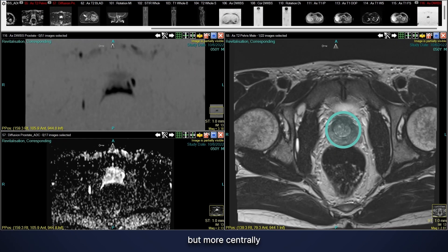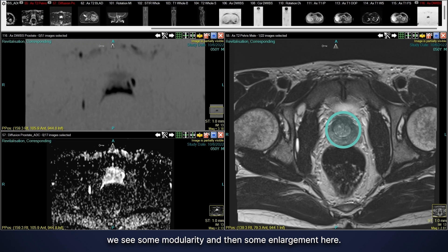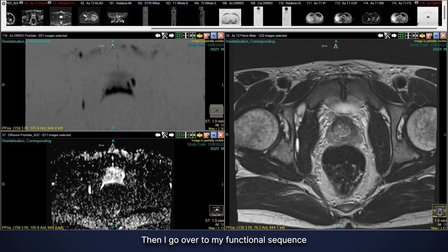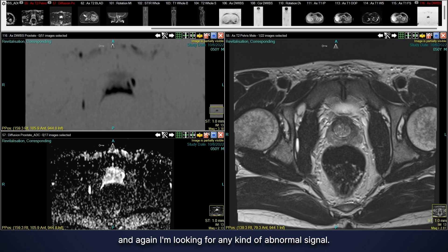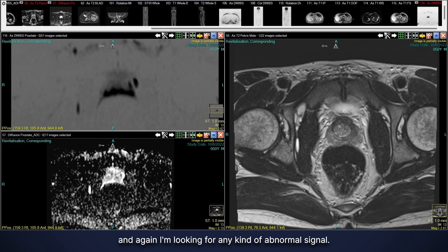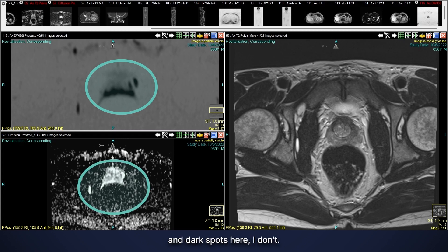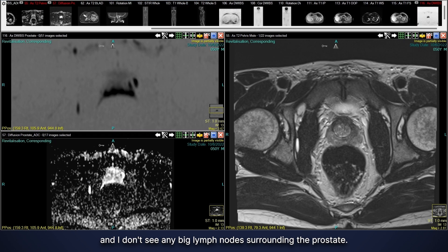More centrally, we see some nodularity and some enlargement, which is typical of benign prostate enlargement. Going over to the functional diffusion sequence, I'm looking for any abnormal signal — any dark spots. I don't see any dark spots, so there are no suspicious findings for prostate cancer.